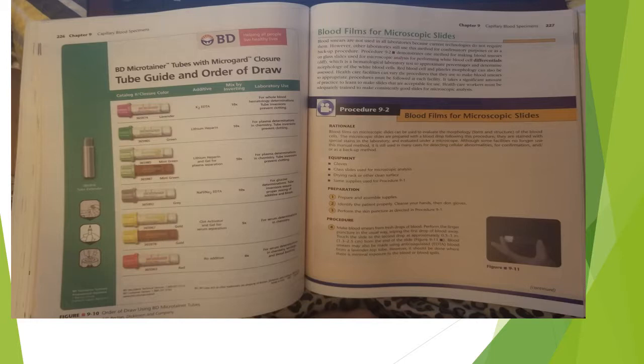Equipment: gloves, glass slides used for microscopic analysis, drying rack or other clean surface, and the same supplies used for procedure 9.1. Procedure: make blood smears from fresh drops of blood. Perform the finger puncture in the usual way, wiping the first drop of blood away. Touch the slide to the second drop at approximately 0.5 to 1 inches from the end of the slide.